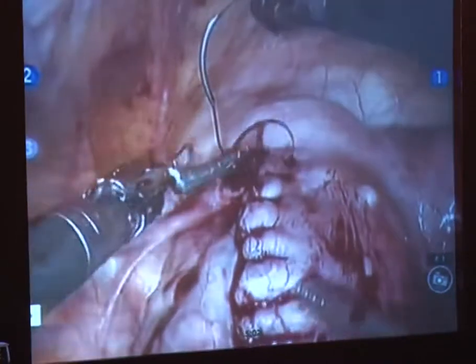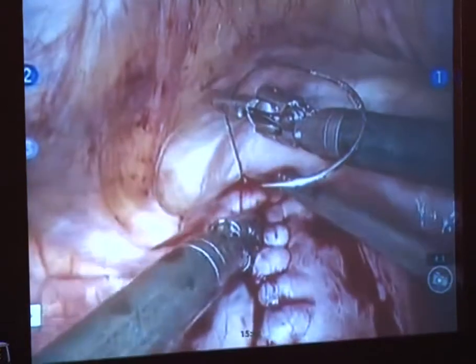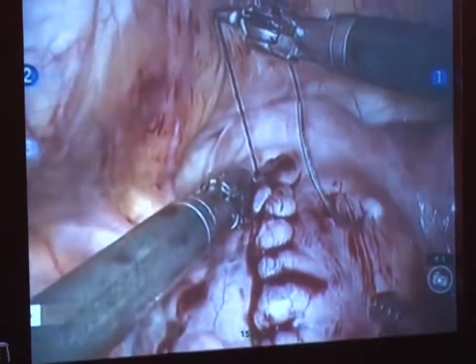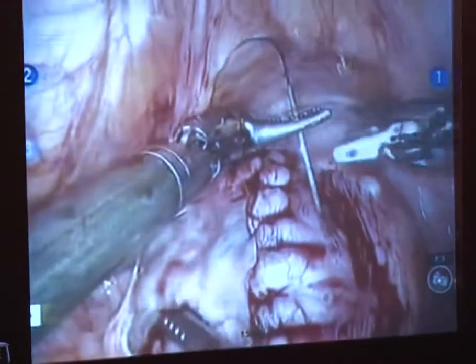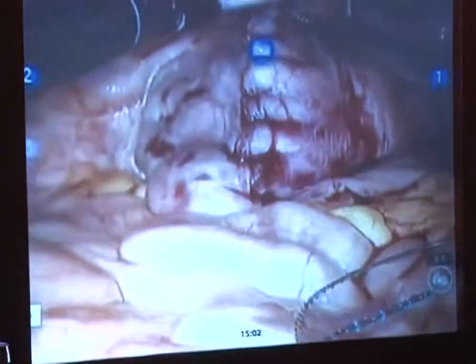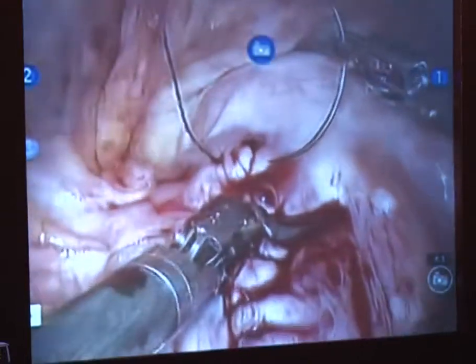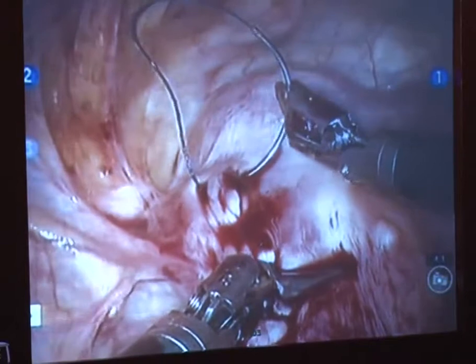I think it's necessary because this patient's going to need to deliver by C-section. She's already had one C-section, but I would recommend that she deliver by C-section. And so who wants to go in there and have the potential of adhesions? Because even under laparoscopic conditions, the rate of adhesion formation is about 40%. It's 98% with traditional laparotomy.